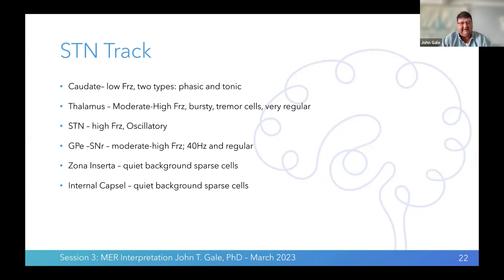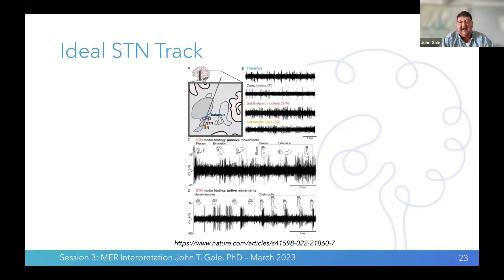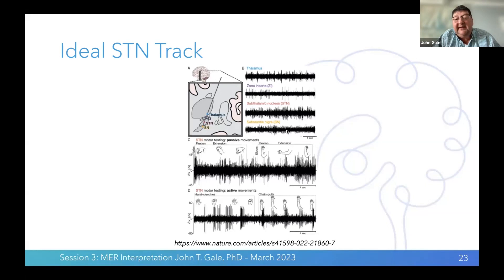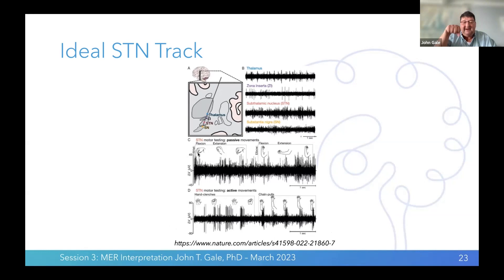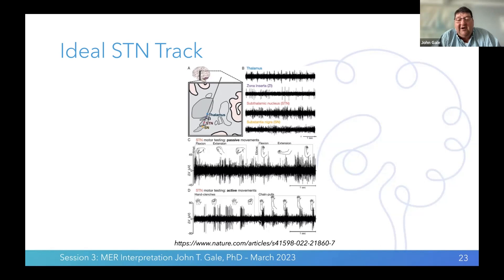This shows how tracks look as we go down: there are obviously different patterns. The thalamus is visible here; there's a sparse neuron in zona incerta but low density. When we get into the subthalamic nucleus, we see many neurons with a pattern — you can see the oscillation in the trace. Below it in substantia nigra pars reticulata, the neurons are firing more regularly. In wake patients, neurons respond to the patient moving the wrist — flexing and extending — with neurons firing with the movements. Other neurons respond to arm movements, hand opening, and muscle activation.